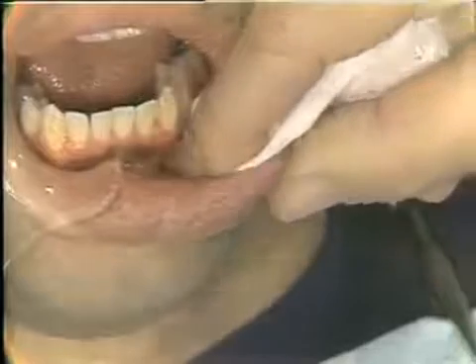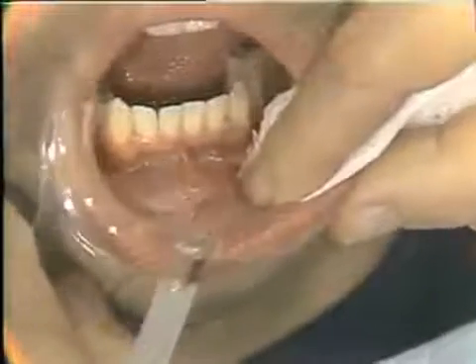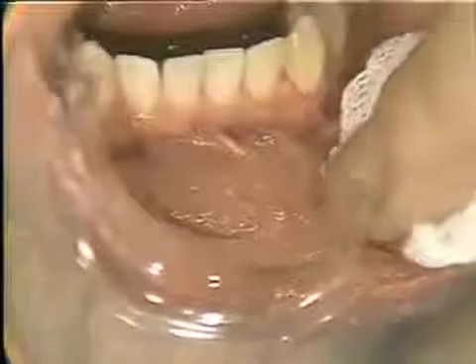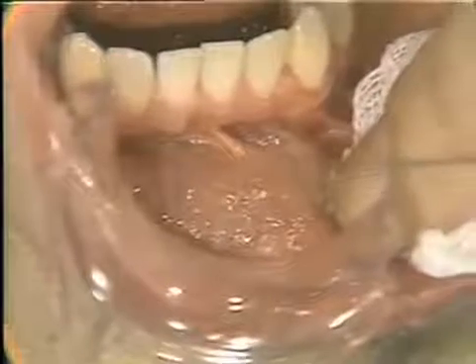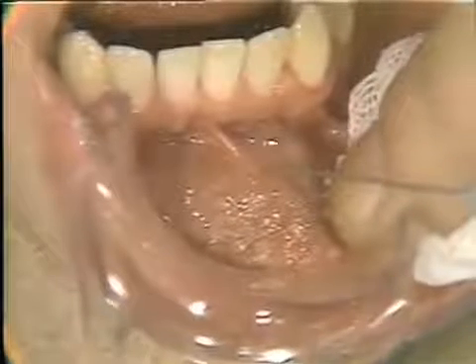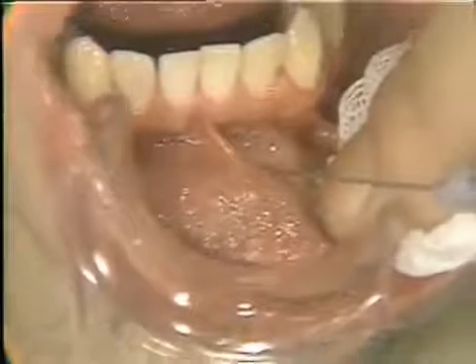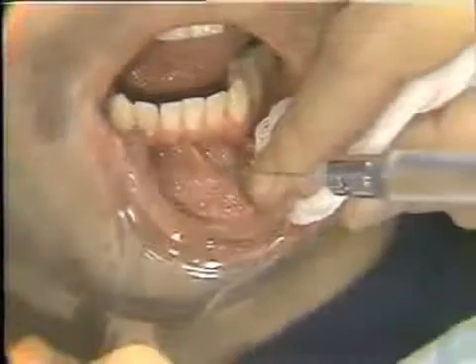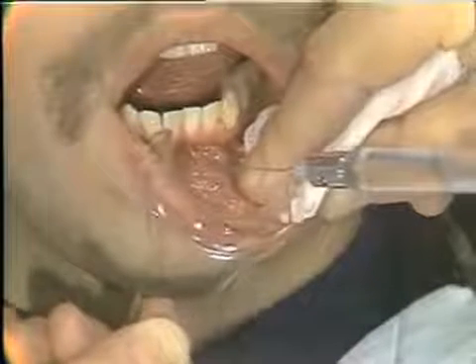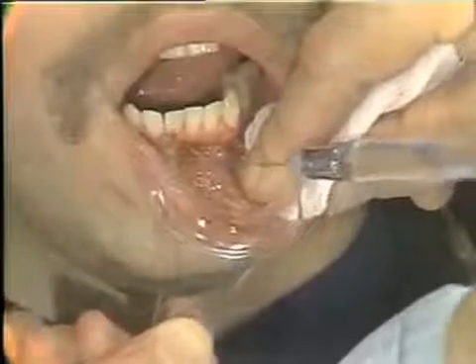And then out quickly. Now, if we were going to anesthetize one of the incisors, we're doing approximately the same thing, only our needle bevel wouldn't be against bone at quite as deep a level, but we would come in the same fashion through the vestibule and carry it quickly to bone at a proper level. Aspirate, and then we would inject approximately a cc to a cc and a half of solution. And then out quickly. All of these anterior teeth can be infiltrated labially in this fashion.